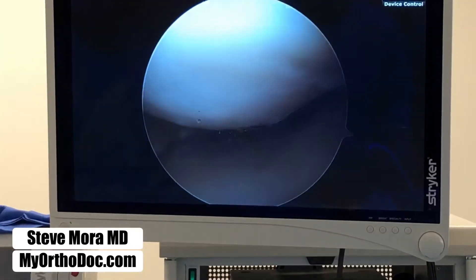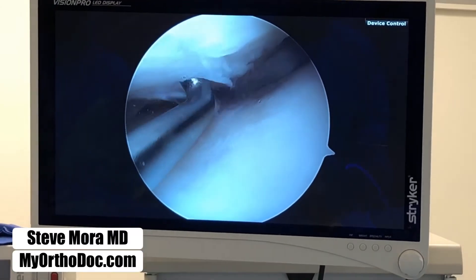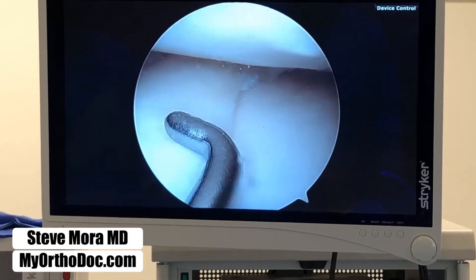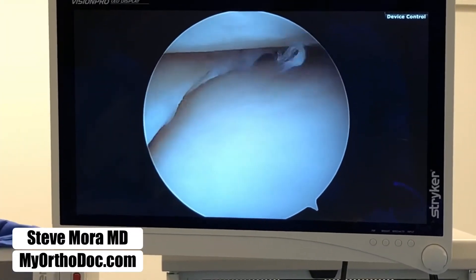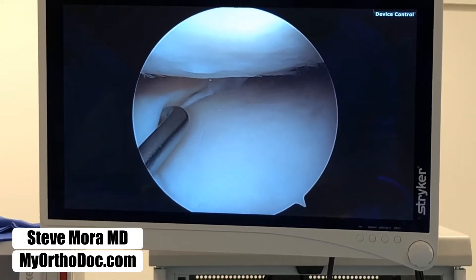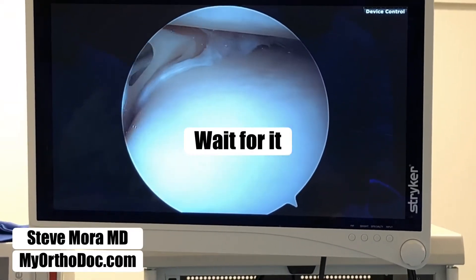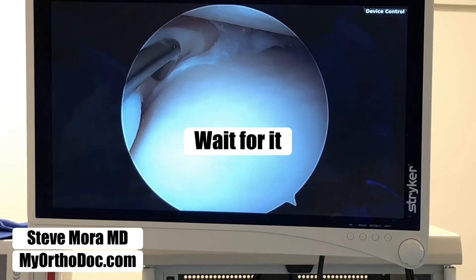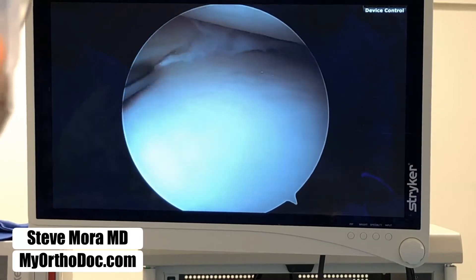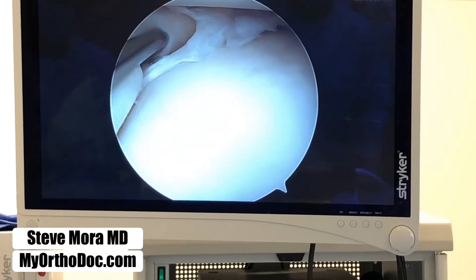I already saw some chondromalacia here — this is causing some of the gentleman's pain. But there's something else. This is the meniscus. I'm sure everybody has heard of a meniscus tear. The medial meniscus is the one that tears more often. I looked at the MRI earlier and was suspicious for a displaced tear. So there's something underneath the meniscus. I use my probe to explore, pull, and prod. I think we're going to find something here.